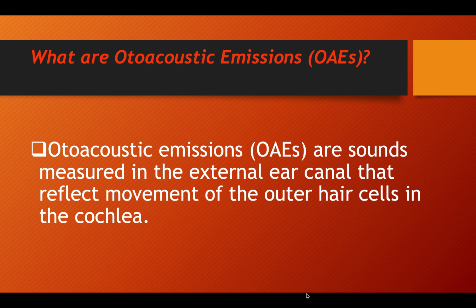First of all, what are otoacoustic emissions? Otoacoustic emissions are sounds measured in the external ear canal that reflect movement of the outer hair cells in the cochlea.